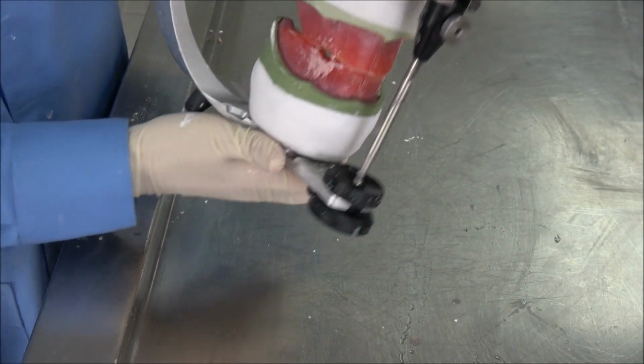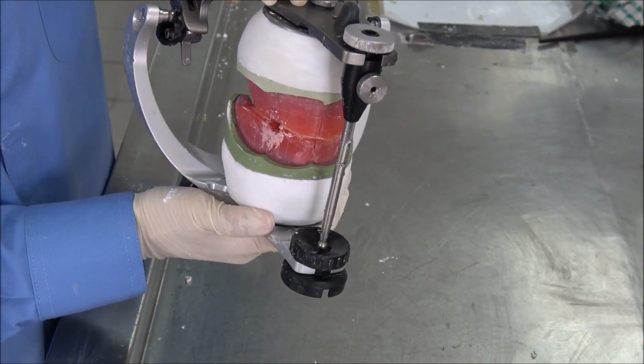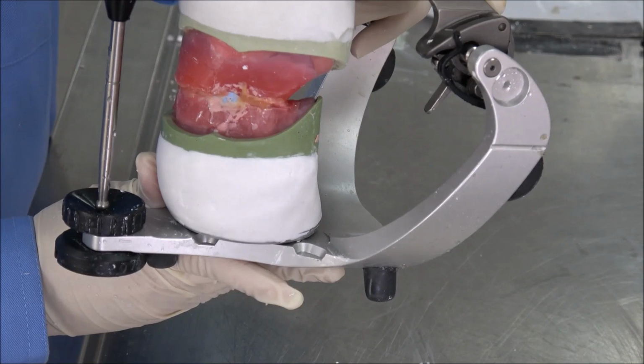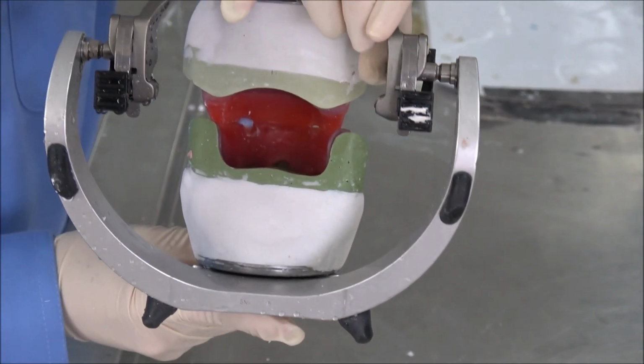Okay, so there is a sample here. Make sure you sandpaper like this. So make sure you clean your articulator properly before showing it to the technician for marking. And the back part, make sure it's clean. Okay.